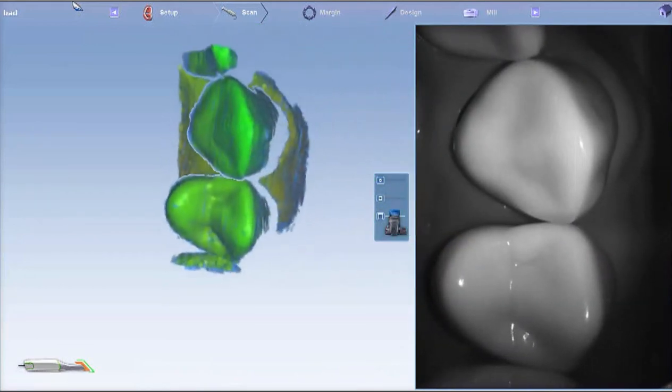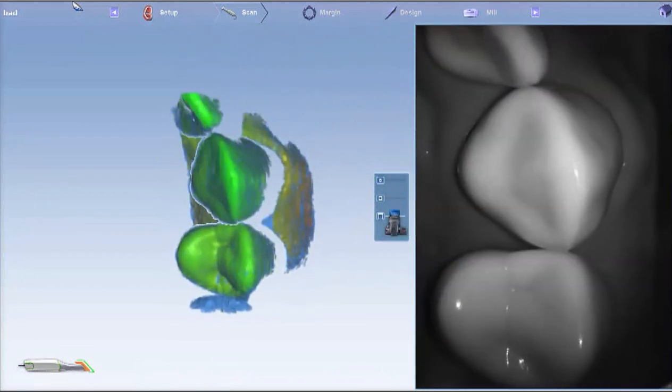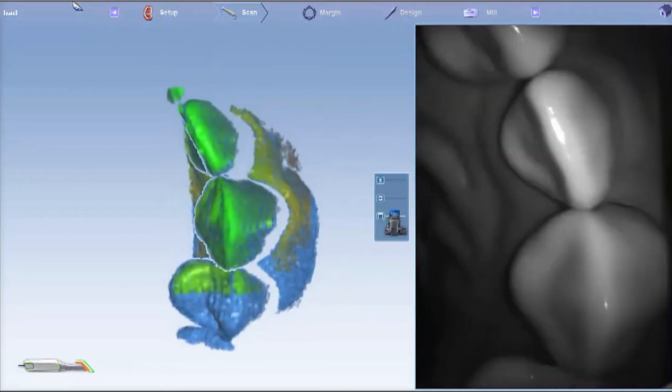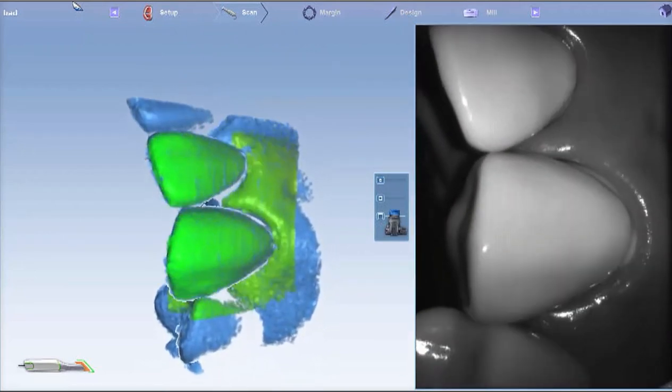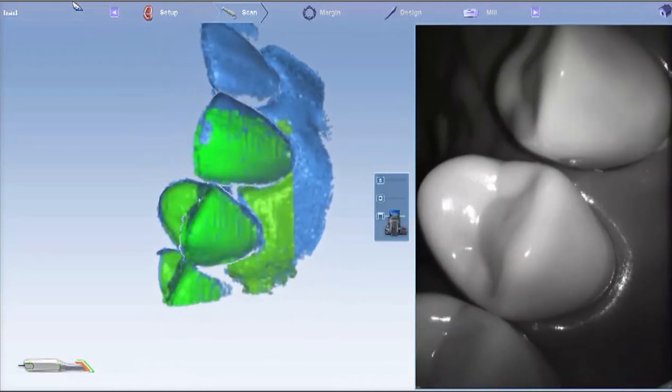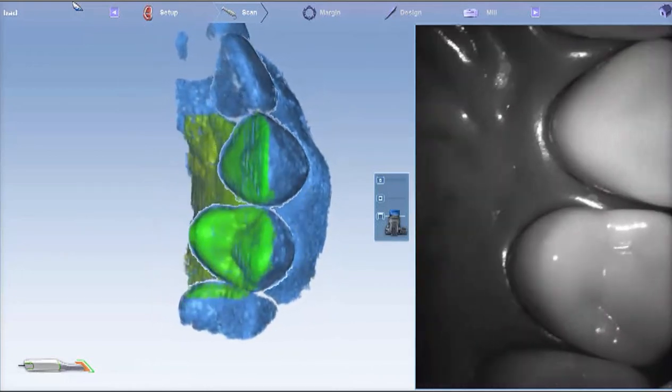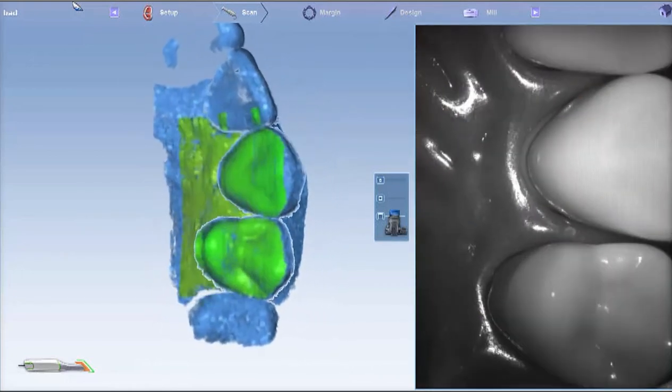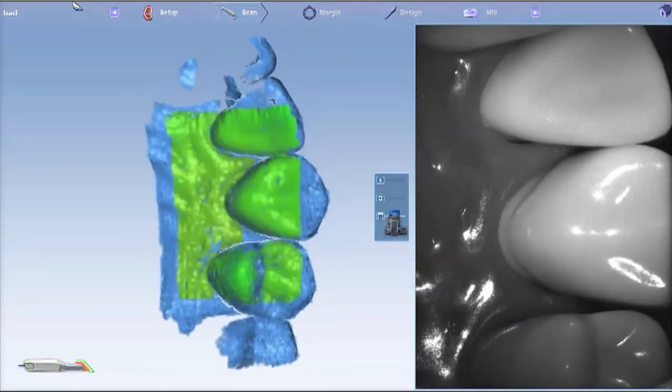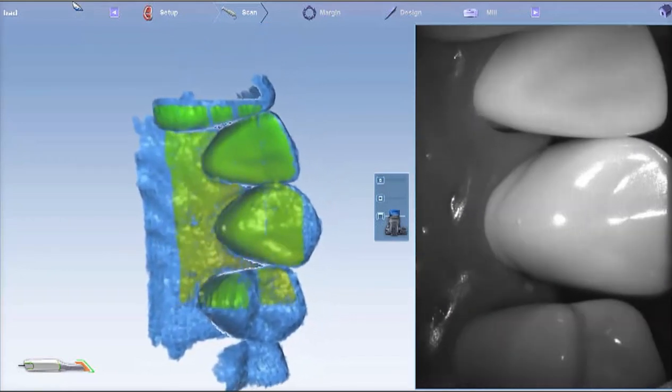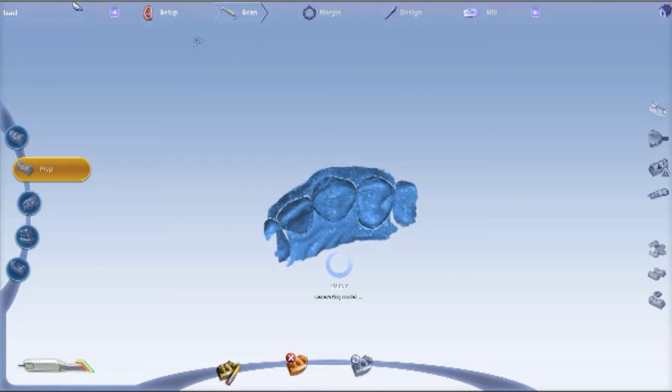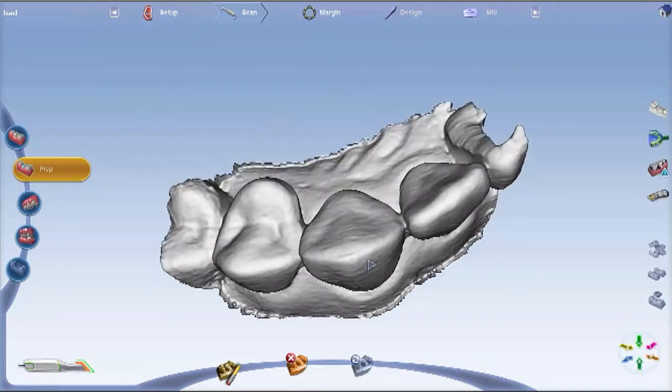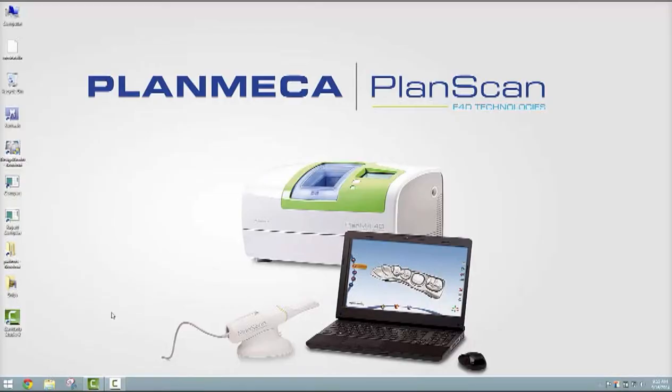In addition, you don't want to scan backwards. Although we have a good incisal view here, the tip is pointed towards the mesial of that cuspid rather than facing towards the distal of that canine. Everything's fine with the scan, you'll just have a little trouble later when you go to align that model. Although the scan will look nice, it's just orientated backwards. We'll find out later what happens when we do that.